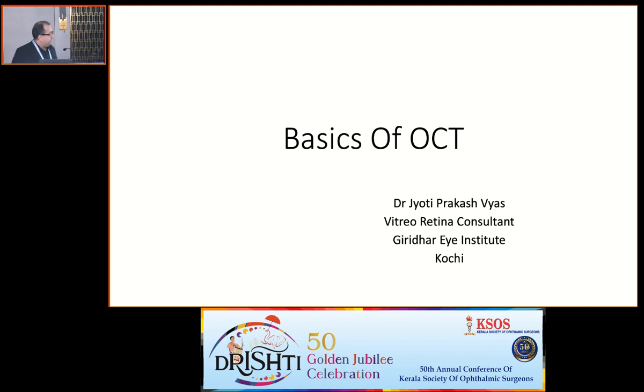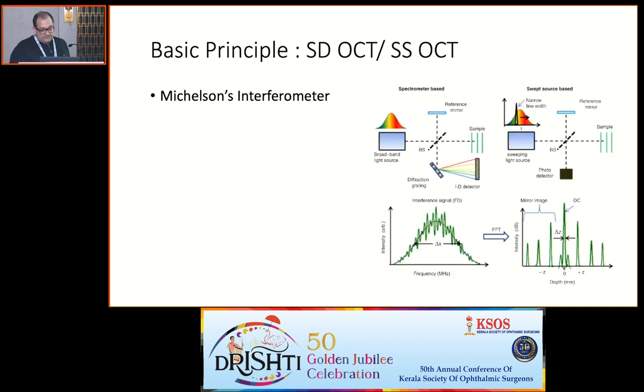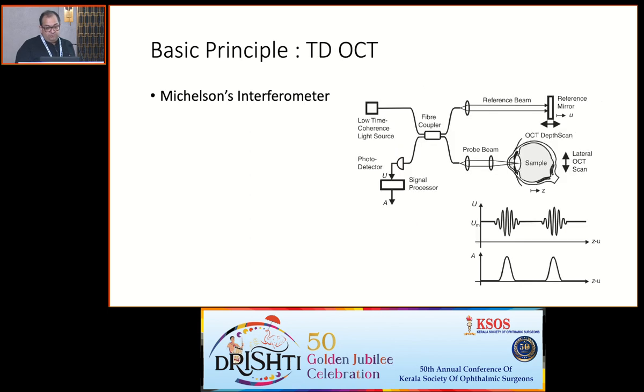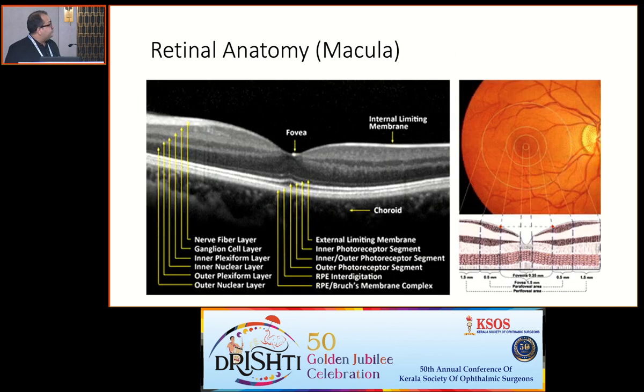Thank you, ma'am, and thank you, KSOS, for the opportunity. I'll be talking about basics of OCT. The basic principle, if you look at it from the postgraduate's point of view, this has been done to death. This photograph has been around for almost 20 years, and nobody understands what it means. But everybody mugs it just for the heck of it. Similarly, that was the time domain, this is the spectral domain. It is just a difference in the light which is used.